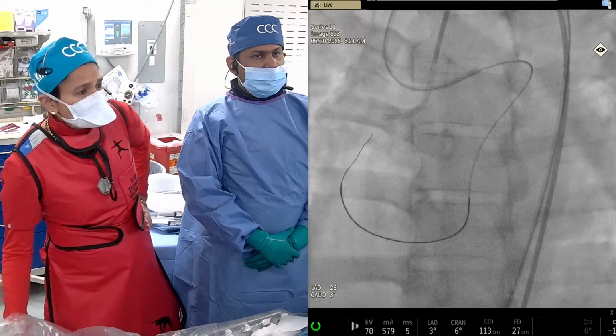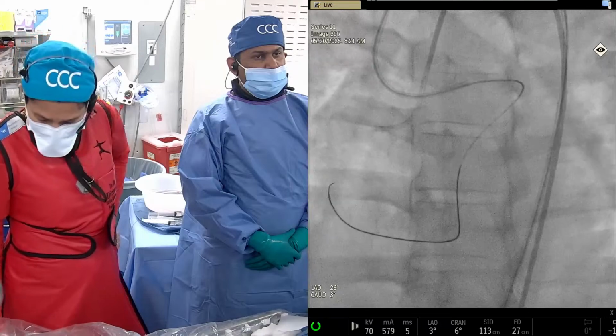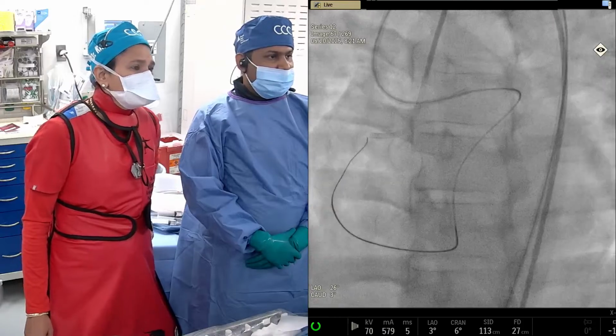Now after this, that was amazing, Anu. You didn't realize it as you were explaining it, your fingers were torquing for us. We watched you. Okay, now when you're here, this is another challenging part.